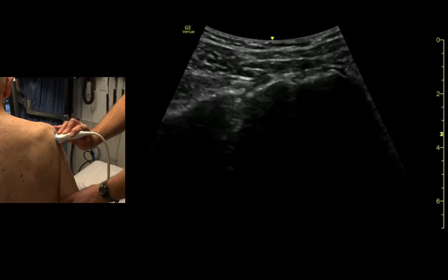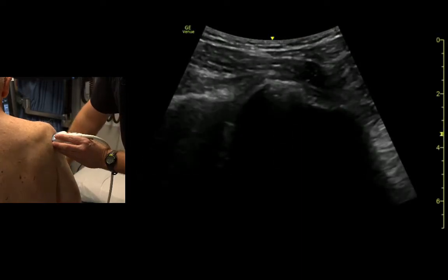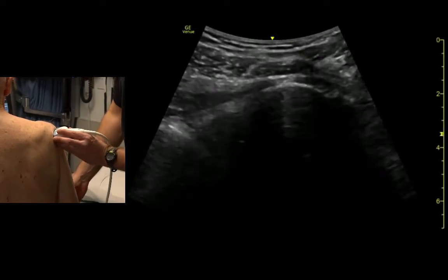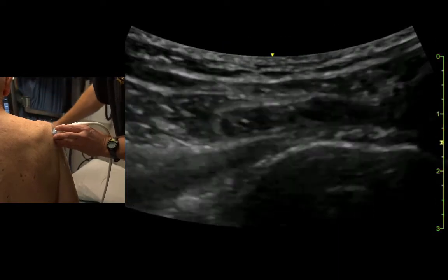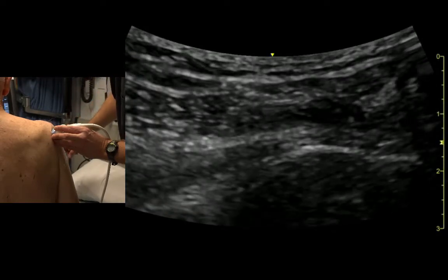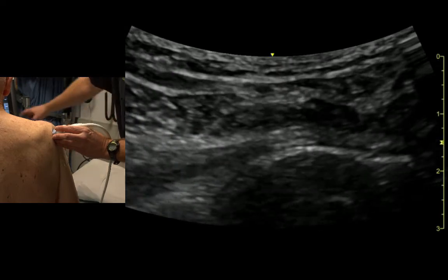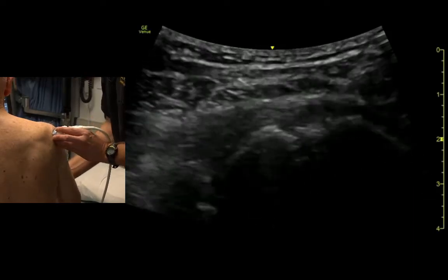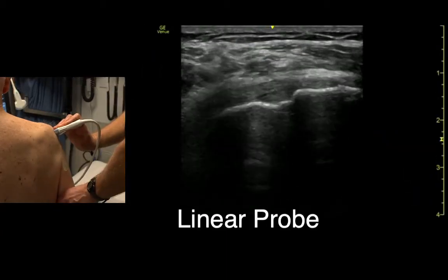There's where the joint is, and I'll often have the patients kind of rotate so I can see the humeral head rotate in and out of the glenoid fossa — it's not really a fossa, but. And if I get up here just a little bit more I can make out the infraspinatus tendon up there, right across there. I can see it pulling the humeral head — there we can see the tendon going across the humeral head a little bit better.